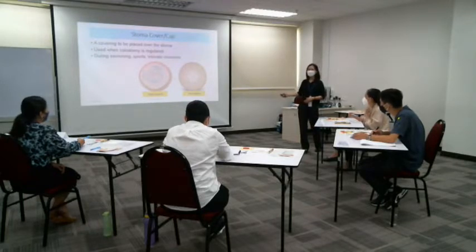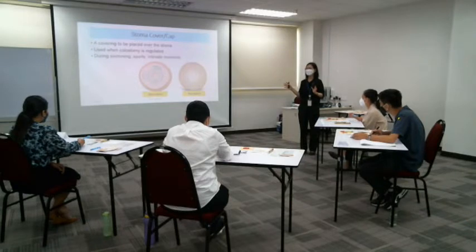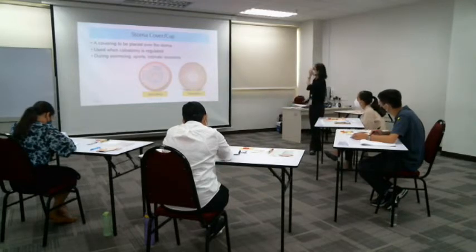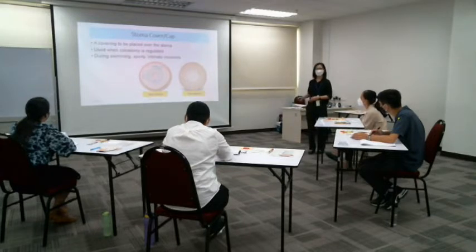This is usually for patients who have undergone the surgery for some time already. Some of them, the bowel is already trained, and the discharge can come out at a more regular interval. In this case, a patient can go swimming or do other sports without having to carry the whole bag. So this is a temporary covering onto the stoma.